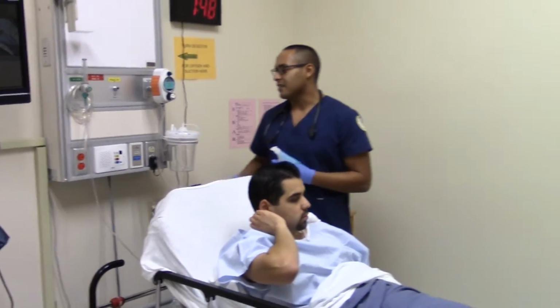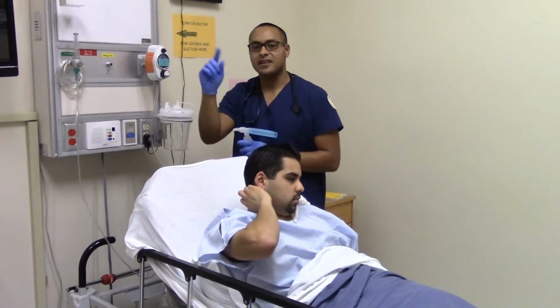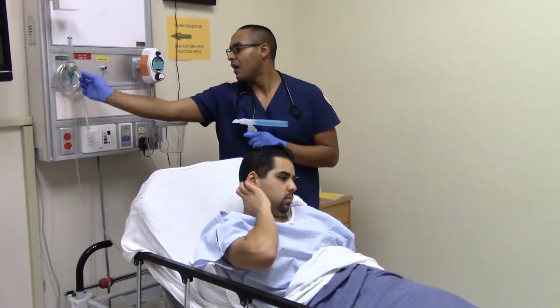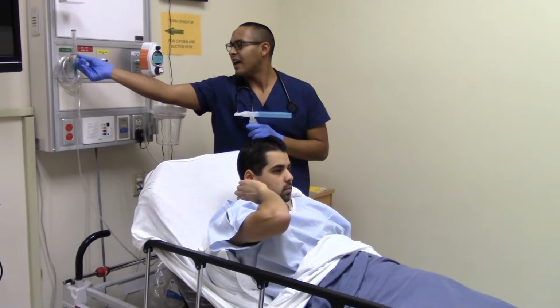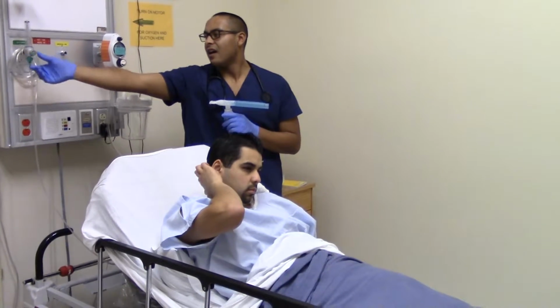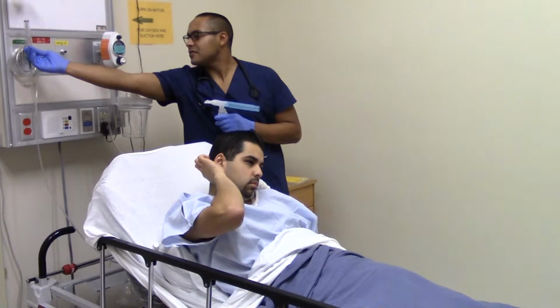And I want to make sure your lungs are doing well. 6 to 8 liters. Doing 7. Okay, go to 6. Start at the lowest if you could.